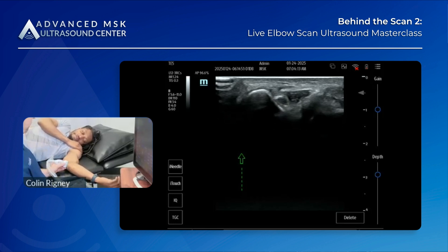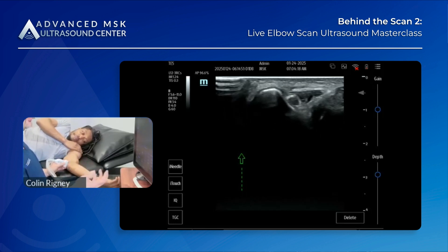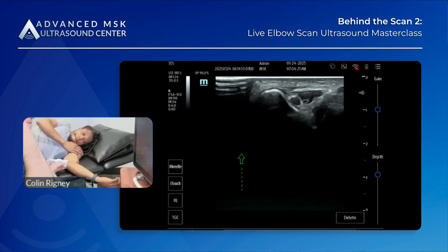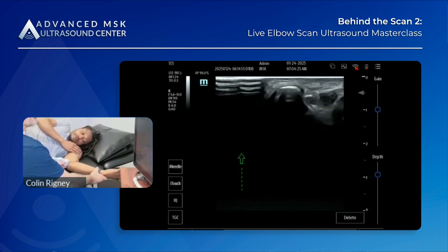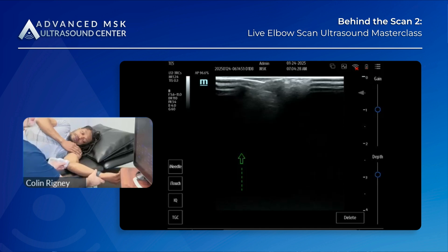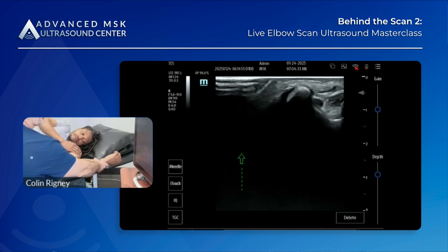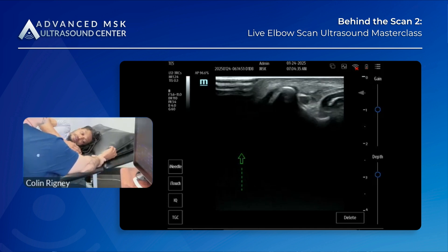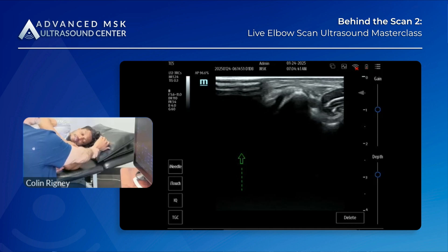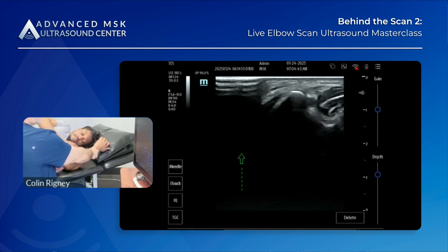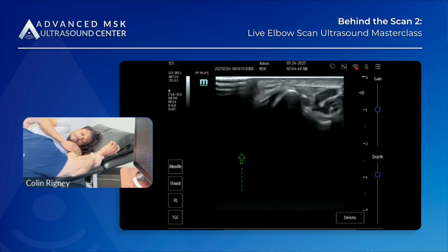Dynamically, subluxation and dislocation are dynamic events — they happen when you flex the elbow. I'm going to focus my transducer on the medial epicondyle because that's where it's going to snap over. Flex the elbow — you can see that nerve, and you can see the potential for compression of the nerve against the medial head of the triceps, but it's not subluxing or dislocating.